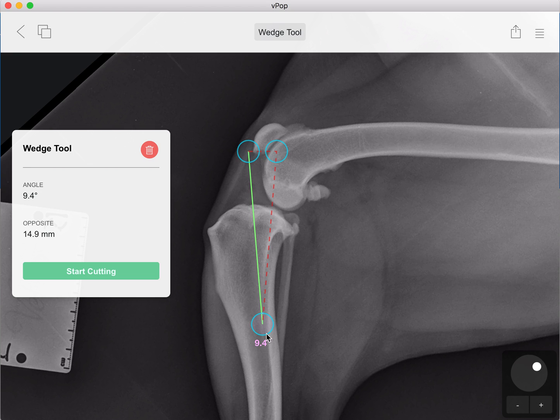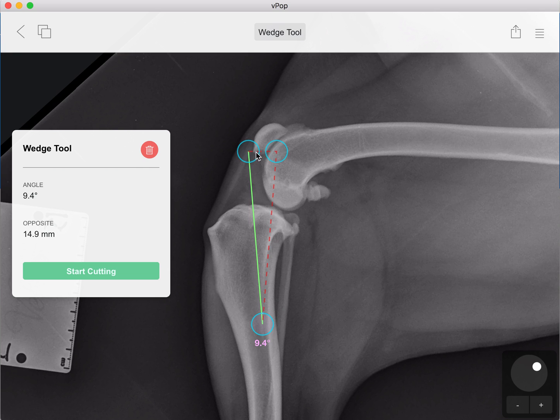The first of the three steps is to simply position your wedge. You've got your apex here, you've got the two sides that you'll be cutting in theatre, and then you have your base section here as well. They're all displayed in your smart palette here. The base section and the angle of the wedge are displayed here.